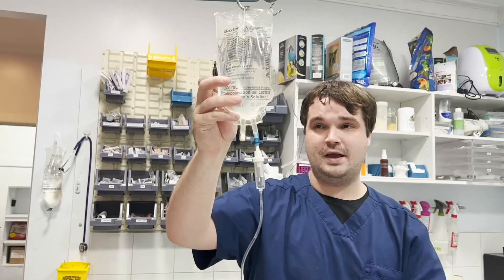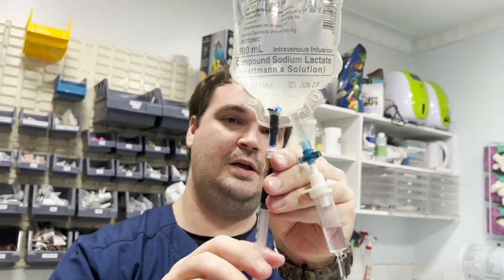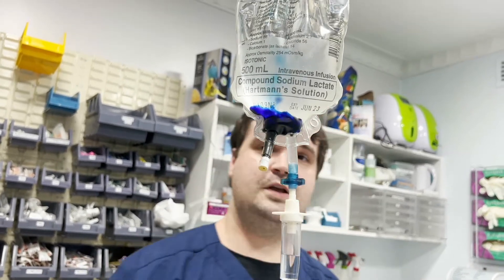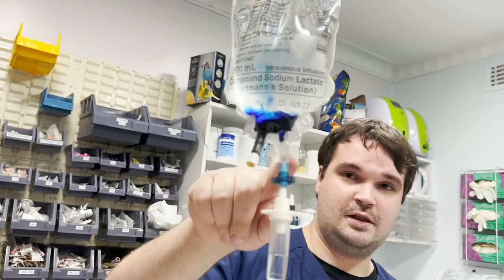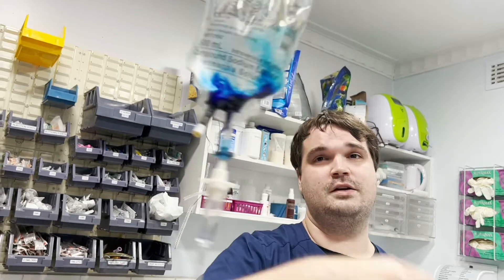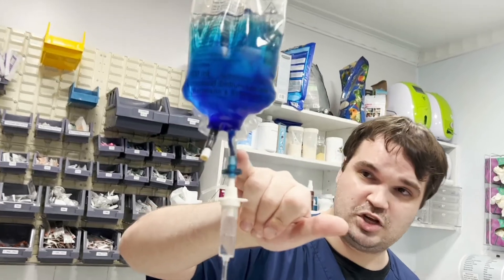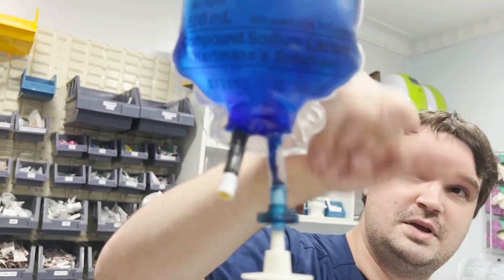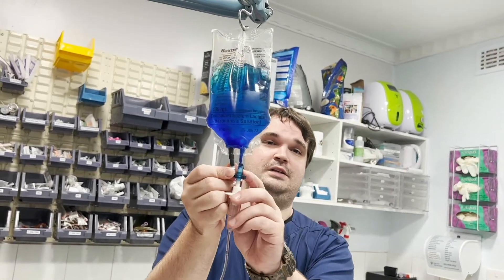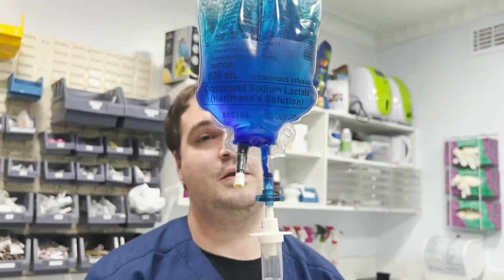I'll demonstrate with a plain bag of IV fluids and some dye. I'm going to inject the dye — and you can see it's all just lingering around the bottom. This is the part that will then go to the patient, and this is the rest of the fluids. Even after being moved around a bit, you can see a big chunk of it here, a little bit of fluid, and then a massive amount concentrated — look at that colour difference. That means it is not evenly distributed.